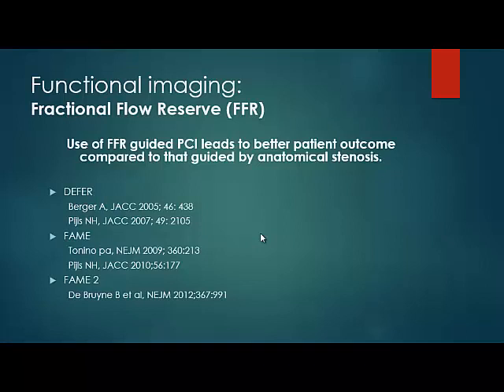And there were a number of trials published on using the FFR in the labs in different categories of patients, particularly those with intermediate stenosis. And patient outcome is better if you treat the patient based on the FFR results.